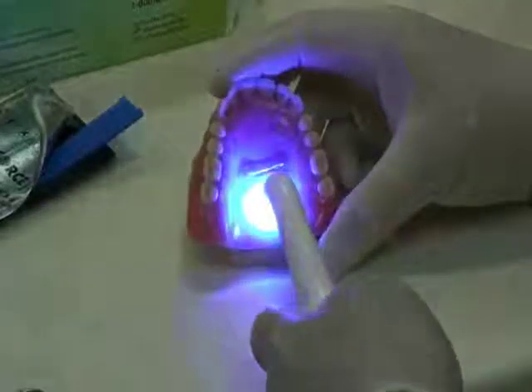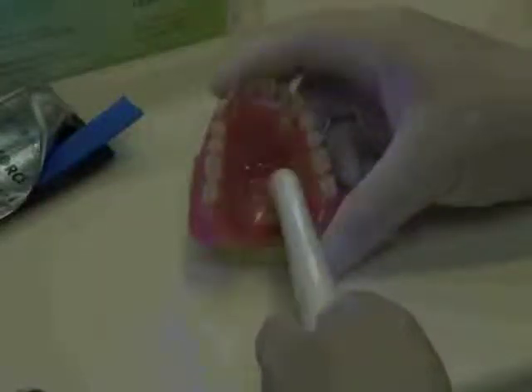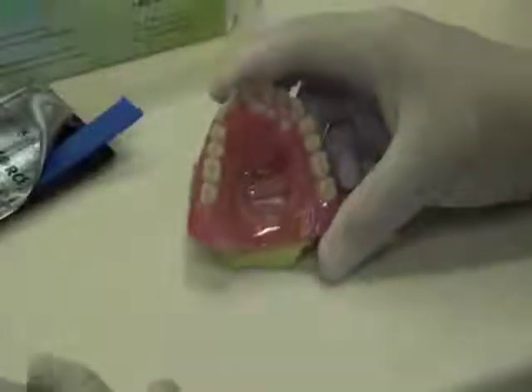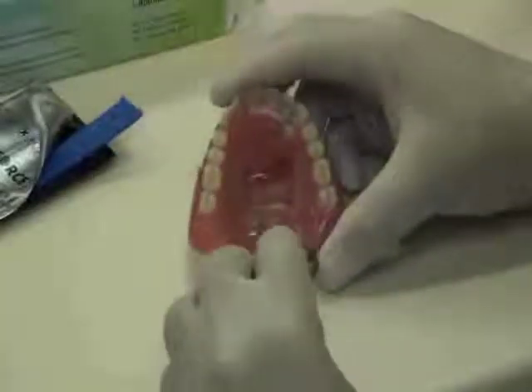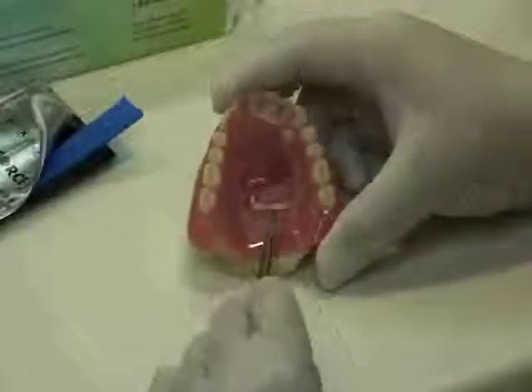Once the Fiber Force is in place, it's light cured. The curing time will vary depending on the power of the unit being used. In most cases, 45 seconds to a minute is sufficient. Once the curing is completed, remove the Fiber Force from the space and place it aside on the bench.